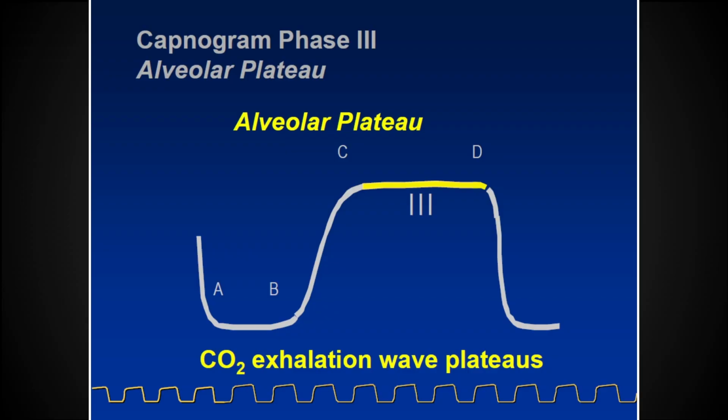Where do you suppose, if you had to point a finger, where is end tidal, this 35, measured? Right, the peak right before it drops. Yeah, right before it drops there at the D point, right?